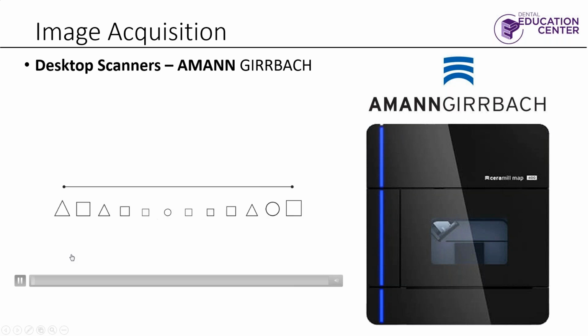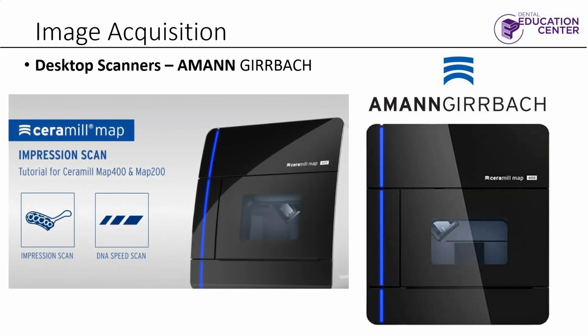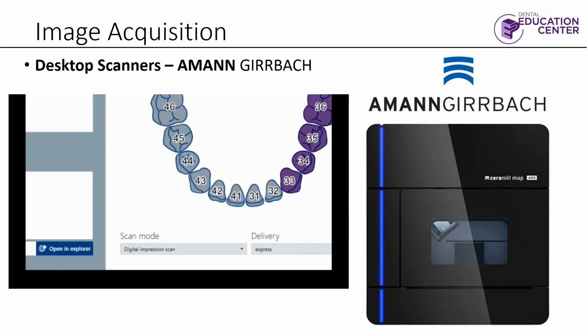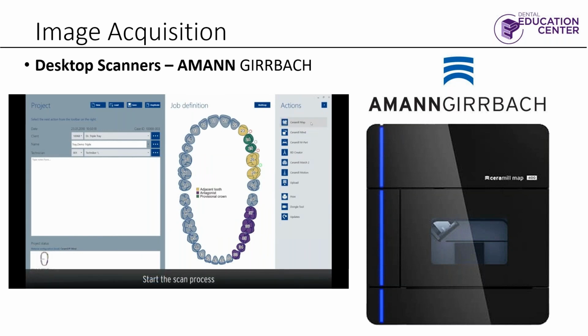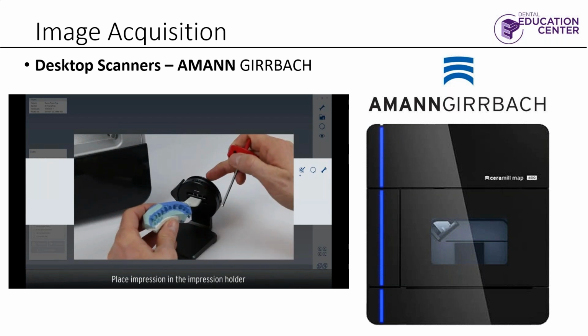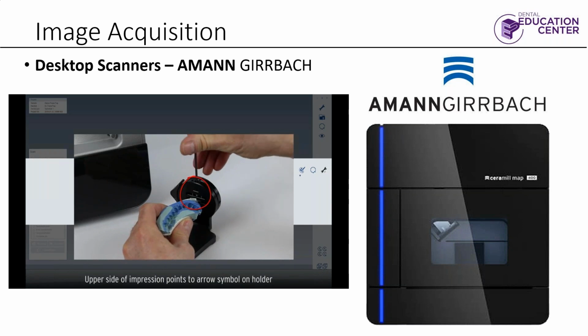Which came on later, and it's relatively new, within the past maybe year and a half. Some doctors might not want to invest in an intraoral scanner. They don't want to train their team, whatever the case may be. So you still can do an impression, and I think there are some doctors that are very good at it and very consistent. And why change? We still had a lot of doctors changing over from darkroom X-rays way back when. But I think it does give them this option, which is nice, to do impressions.